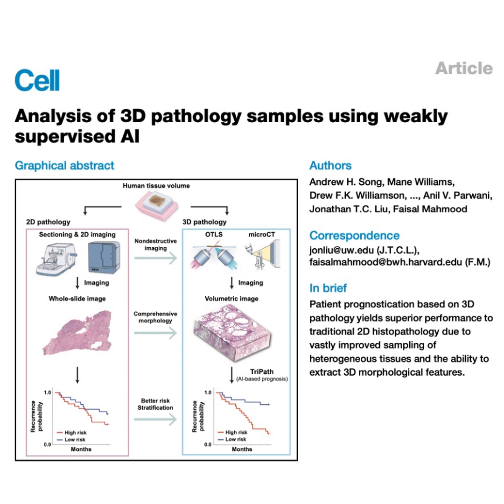This is where it really clicks. The patches with high positive IG scores, the ones TriPath flagged as most indicative of recurrence, consistently showed morphology that pathologists already know is bad. Things like infiltrative carcinoma, glands that looked poorly formed or fused together, what pathologists call Gleason pattern 4, and complex, messy structures like cribriform architecture, all known markers of aggressive prostate cancer. Okay, that's reassuring. It's not finding some weird, uninterpretable signal. It's identifying known high-risk features.